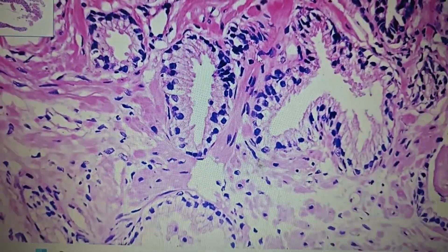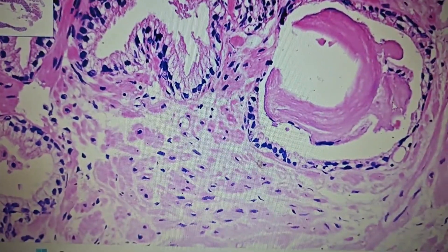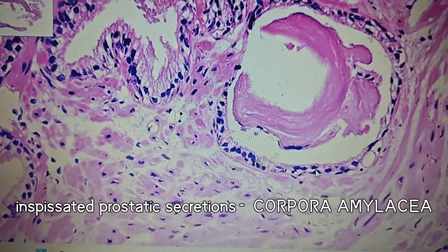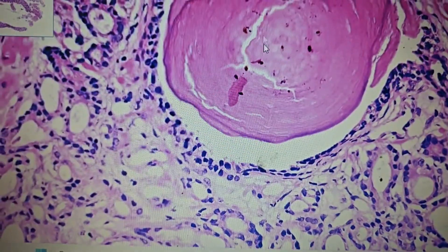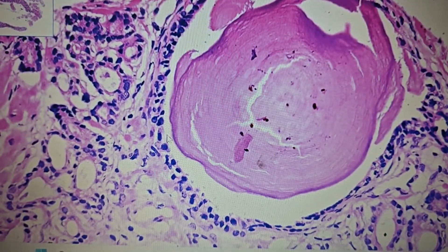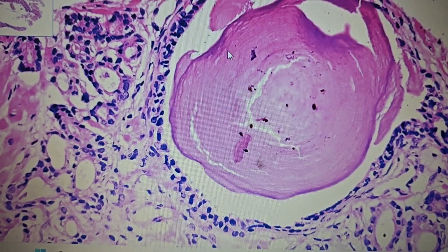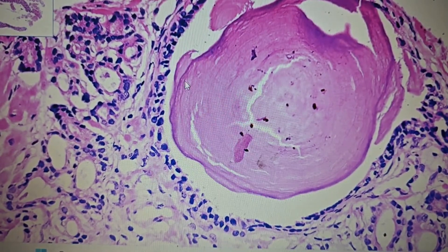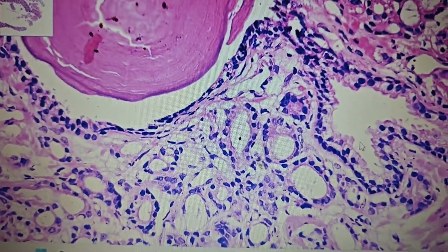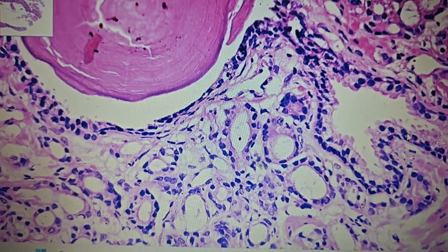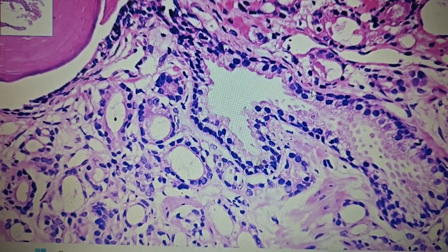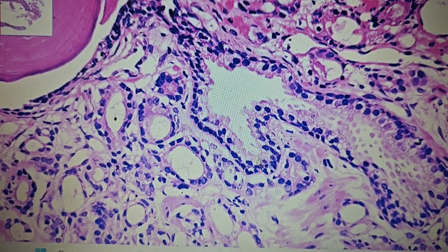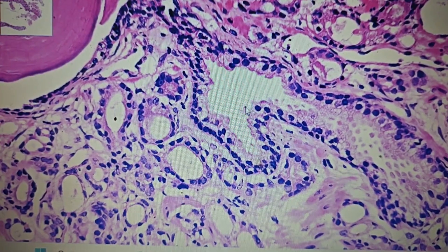These benign prostatic glands sometimes contain prostatic secretions which are inspissated and are known as corpora amylacea. Here you can see another focus — these are benign glands with double-layered epithelium, and inside there are inspissated secretions with a laminated appearance, which are corpora amylacea. These dilated benign glands also sometimes have papillary infoldings, and the inner secretory layer causes secretions in the lumen of the gland.